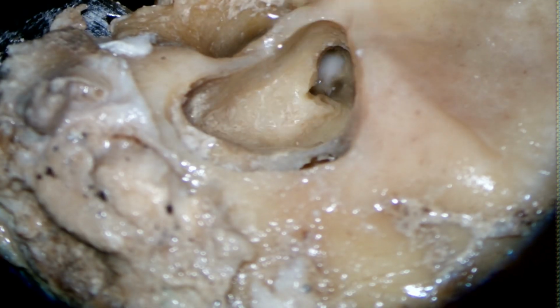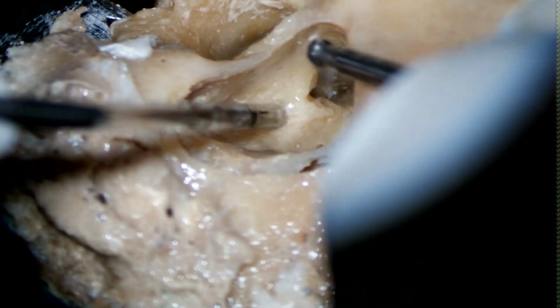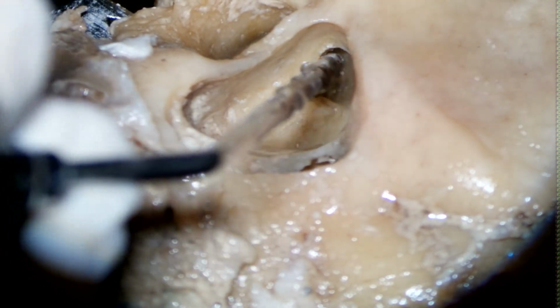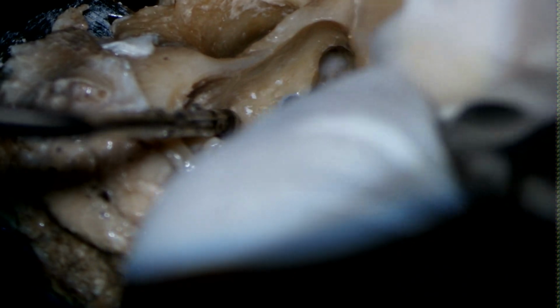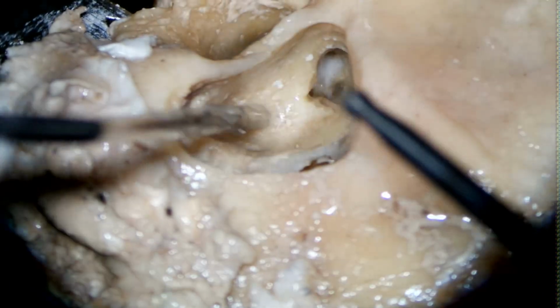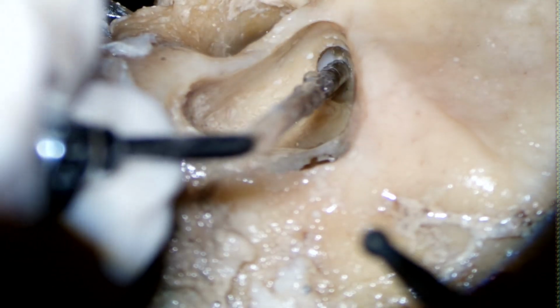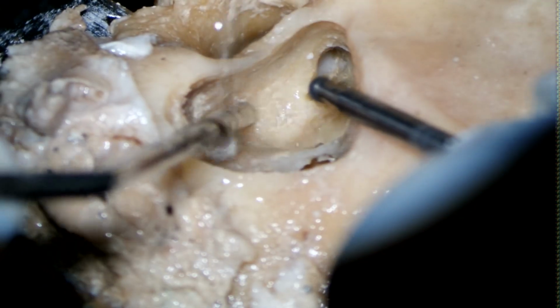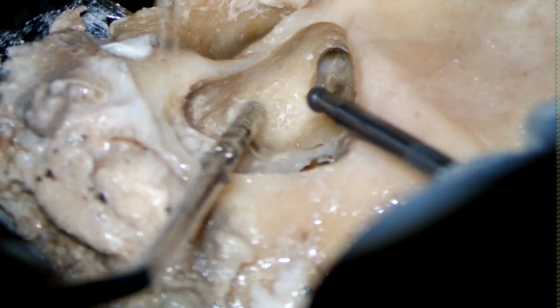So what is the chordofacial angle? Anybody can tell? What is the chordofacial angle? Yes. So what is the normal value? Yes. So I'm not able to still. Do we have a diamond burr?